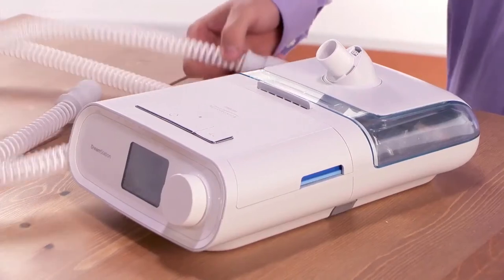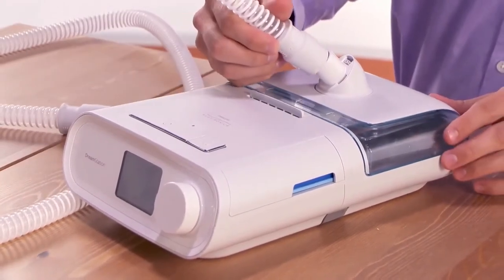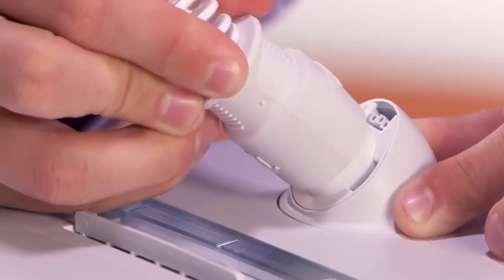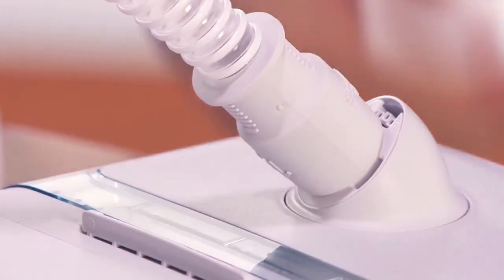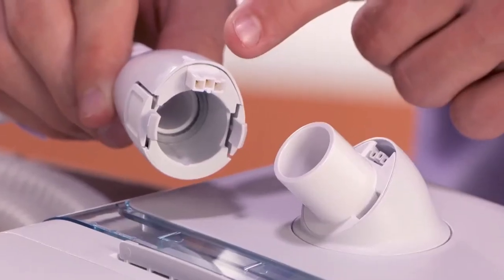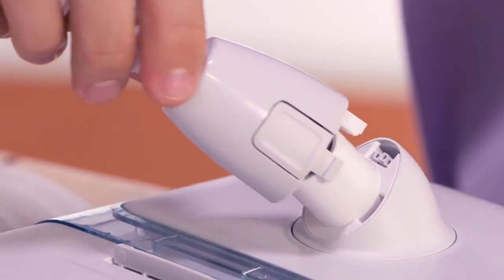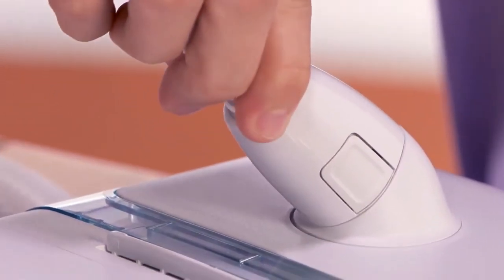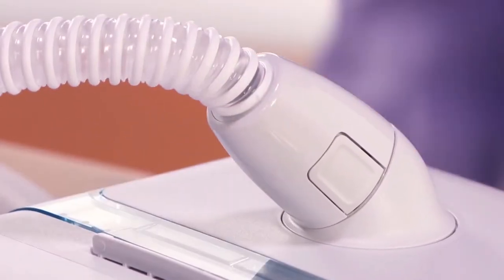To assemble the breathing circuit, connect one end of the flexible tube to the air outlet port. If you are using a heated tube, line its connector up with the top of the air outlet port. Press the heated tube over the air outlet port until the tabs click into the slots.